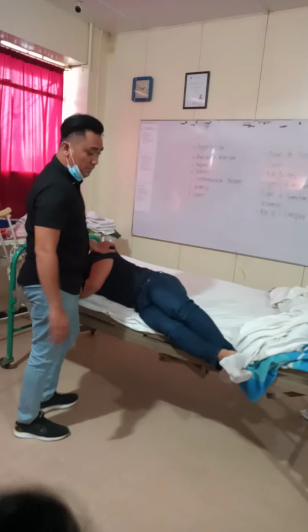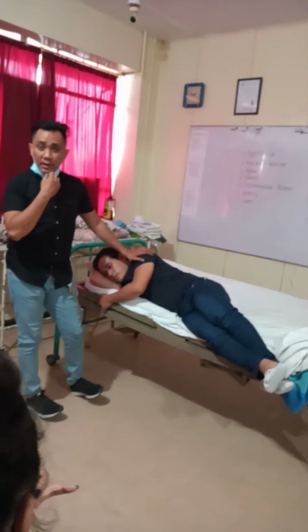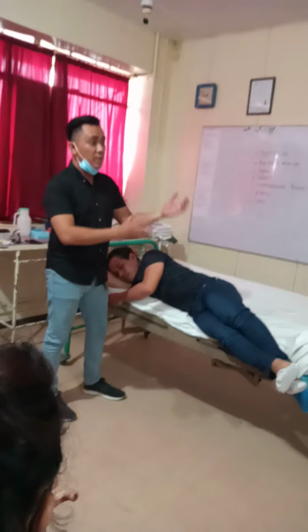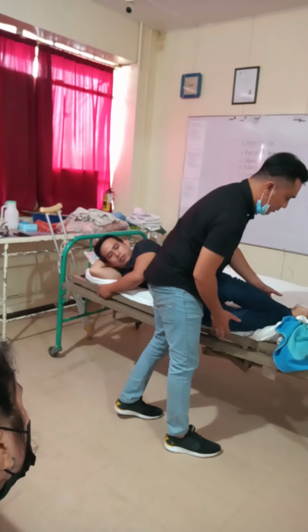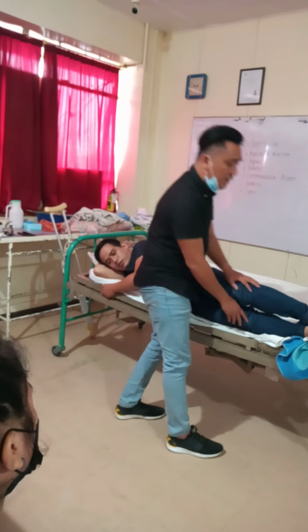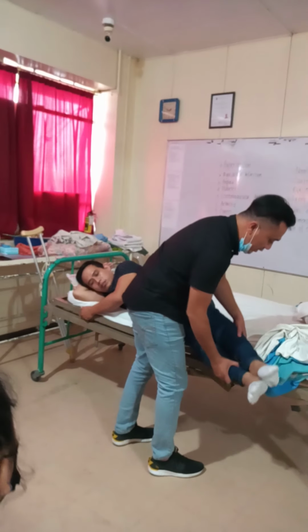Great. Now, there's a reason why ganun i-drop na to ang duha ka tiil ni patient. Okay? Para palingkod na to niya, naka-drop na daan na iyang tiil. If ever magud ang tiil ni patient is naa dire, straight mo tiil, win. If ever na siya dire, maglisod mong palingkod na niya. Okay? So let's start first with what if nakabintay siya.